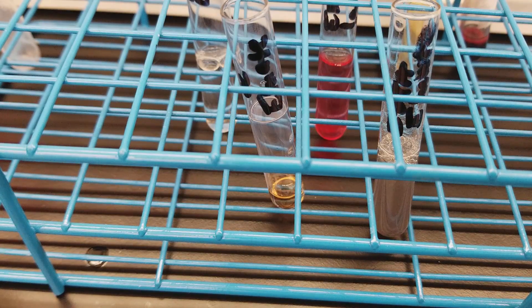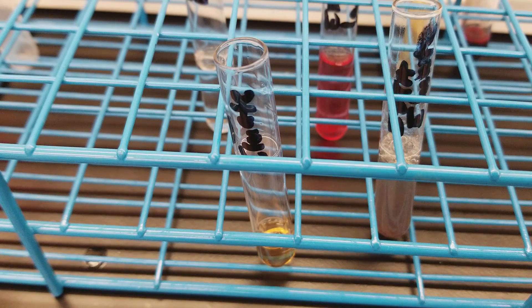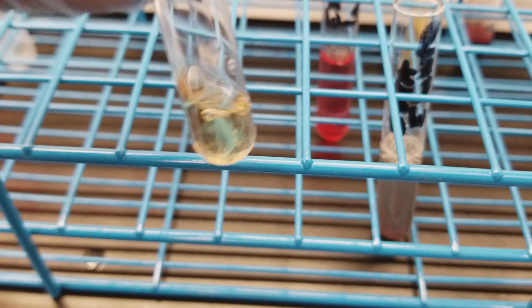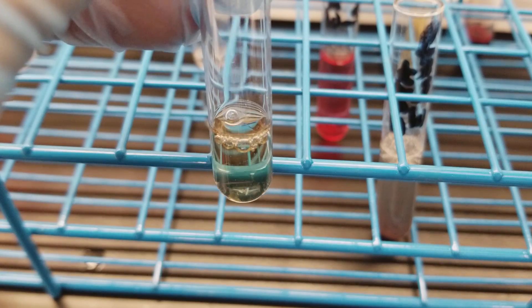Now we're going to do the little one. We didn't have a whole lot in there, so we're going to add as much as it takes to turn this one blue, which looks like it's not going to take very long. This is almost like a titration — I'm just not using really precise equipment. There we go — that showed up nicely. We'll keep that.